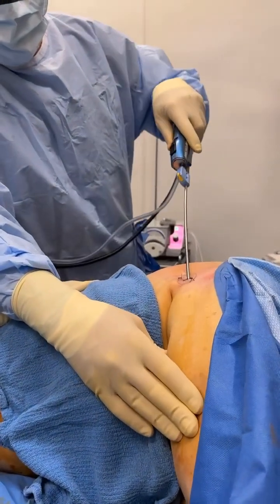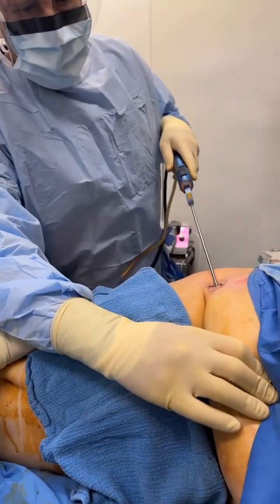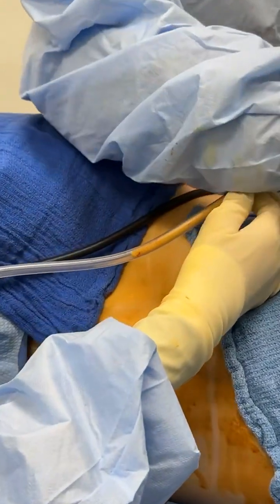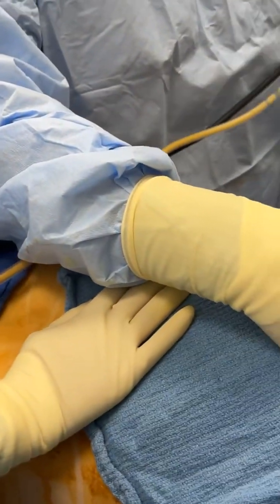We're doing liposuction here, but I want you to see what comes out, okay? Basically, it should be all yellow, beautiful fat. And notice how I am using my non-dominant hand. I'm right-handed, but I'm using my left hand.